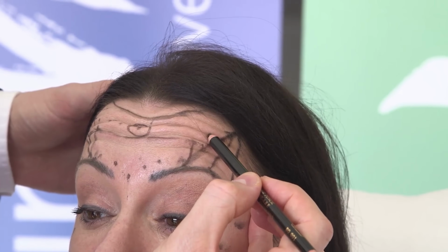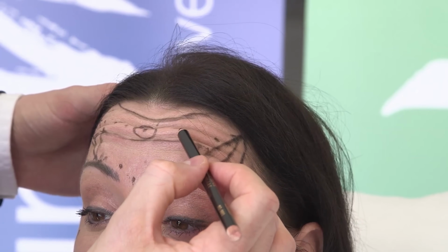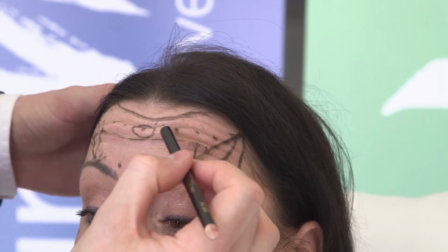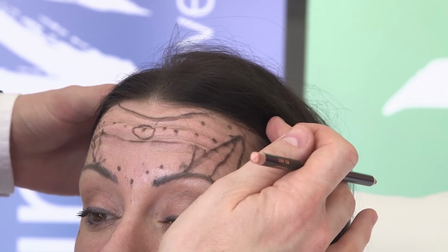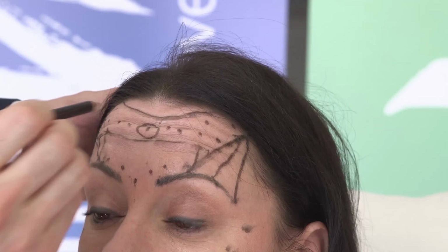To spread them evenly, I work by dividing the area up first in half and then in half again, placing my planned injection points at logical positions so that in the end I fill the space efficiently and symmetrically. It's vitally important laterally that you are symmetrical, if the face is symmetrical. Small changes in the position of your lateral injection lead to large changes in the relative size of the untreated muscle, which means the relative size of lift. Asymmetrical eyebrows do not go unnoticed, so work hard to do this very neatly.